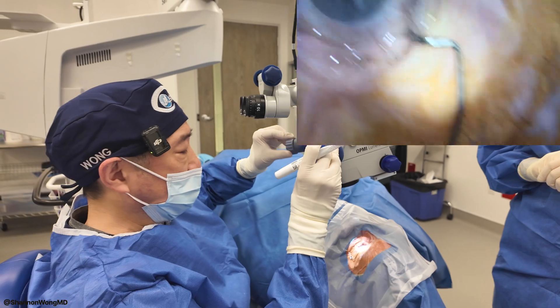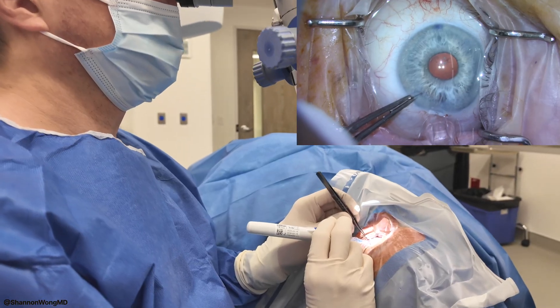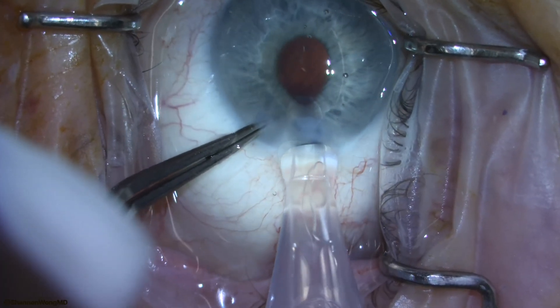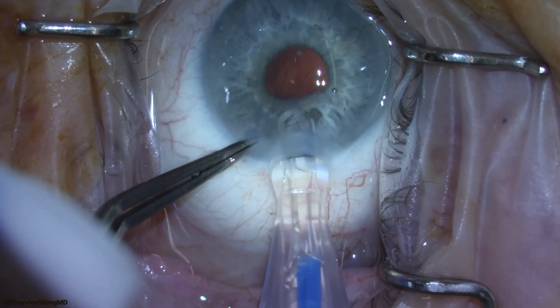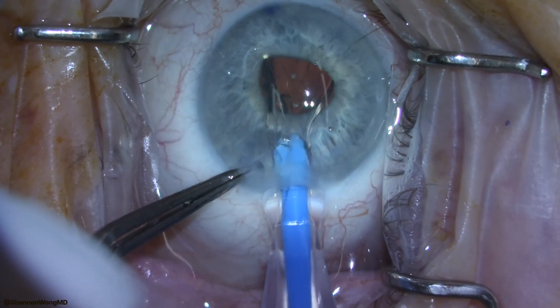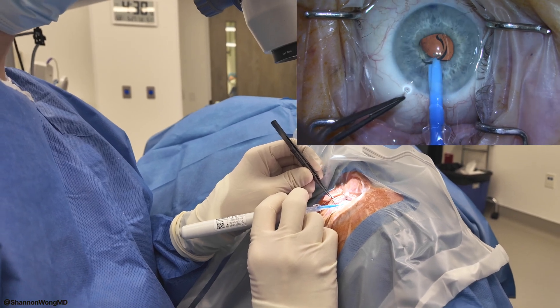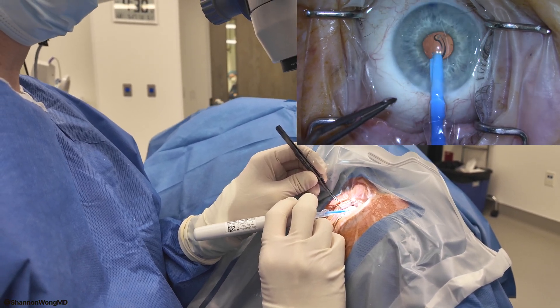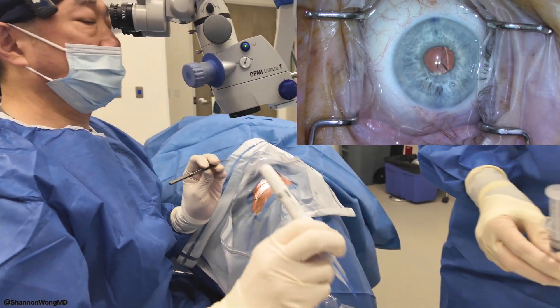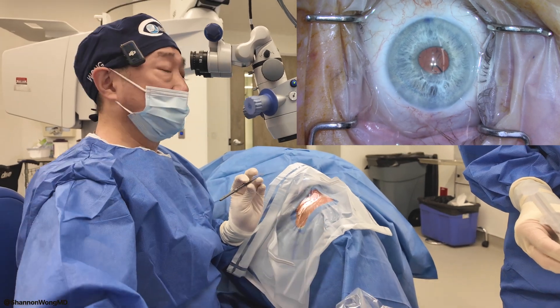Now here comes our lens. This is a small pupil, so this will be fun. You'll feel a little pressure — stay as steady as you can. This is the lens going in. Great, it's pretty smooth. This is my first use of the Autonomy. So that's what it looks like once it's been delivered.